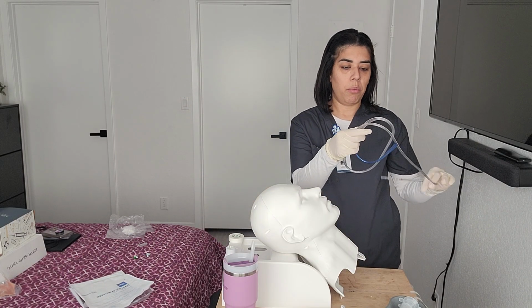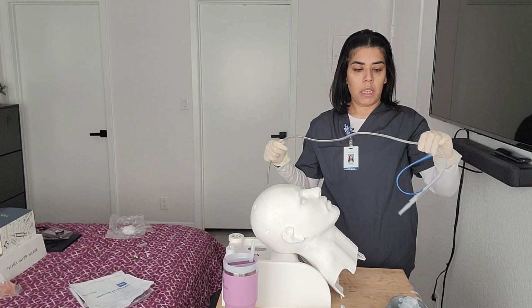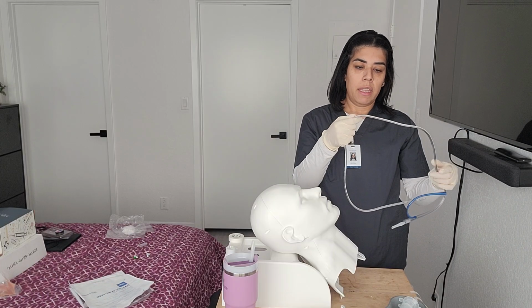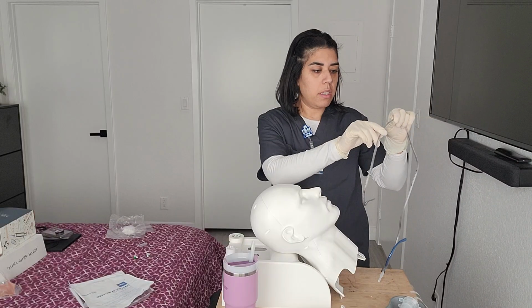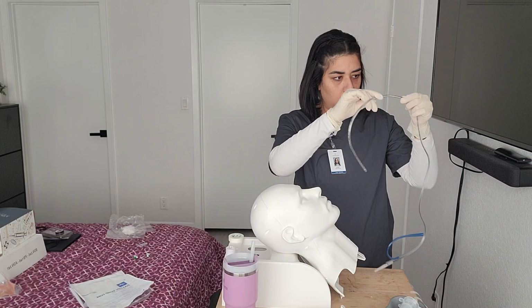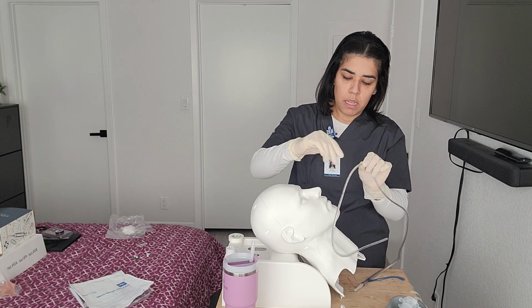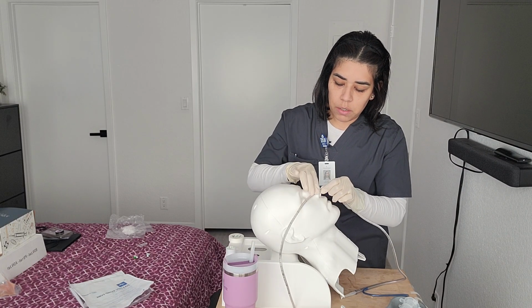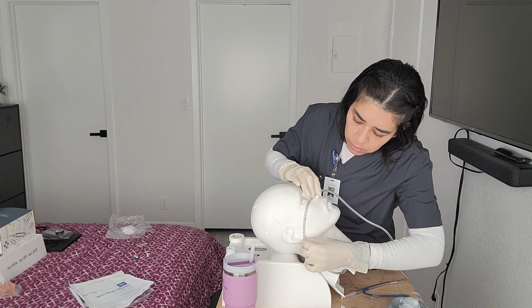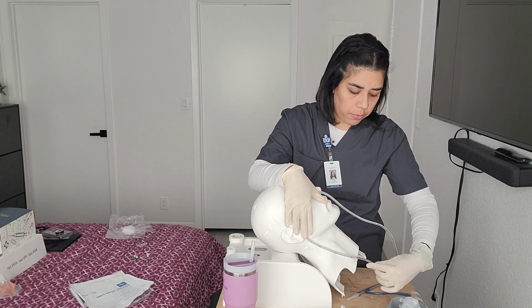So we've already brought it out. We're gonna measure from the tip of the nose to the earlobe down to the xiphoid process. So we'll do it this way. All right, sir. So here, tip of the nose to the earlobe to the xiphoid process.